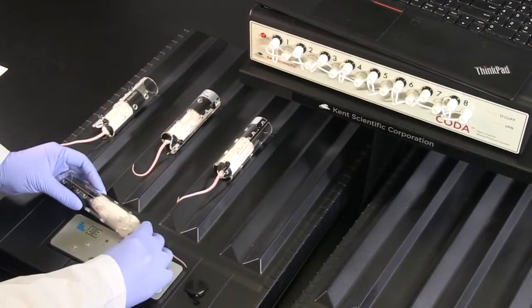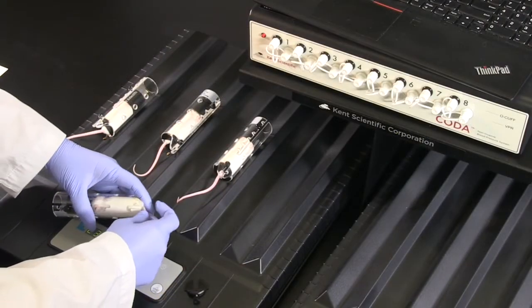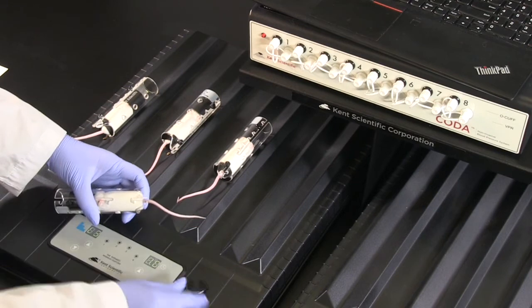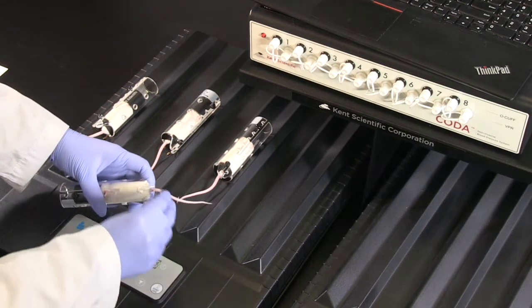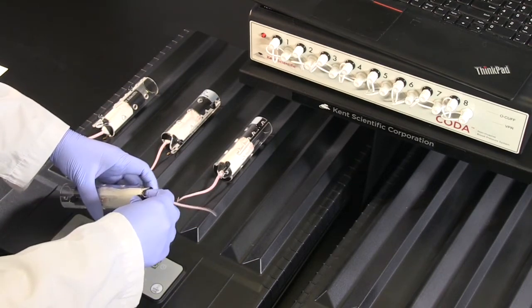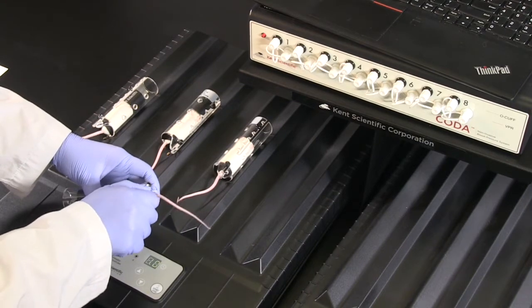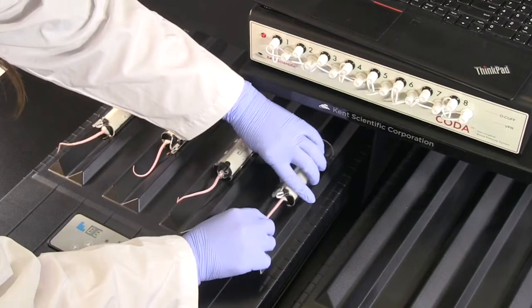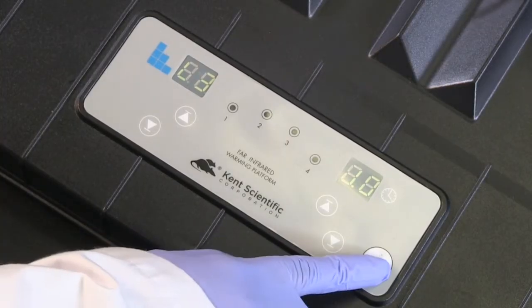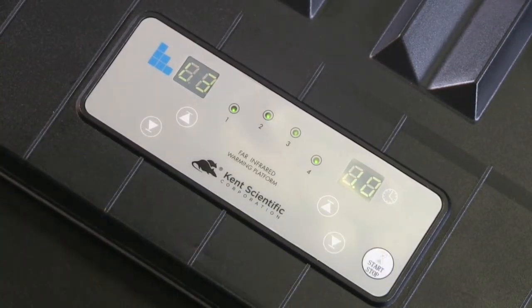The animals require a few minutes of acclimation time before taking blood pressure measurements. This acclimation is important to ensure proper tail blood flow and to reduce any effects of handling and restraint stress. To save time, gently place your animals into the CODA holders and turn on the warming platform to acclimate the animals during the software setup process.